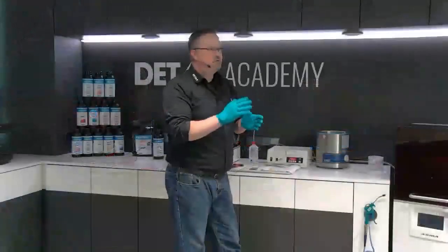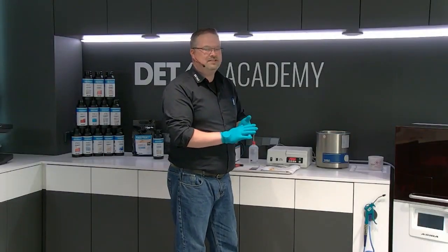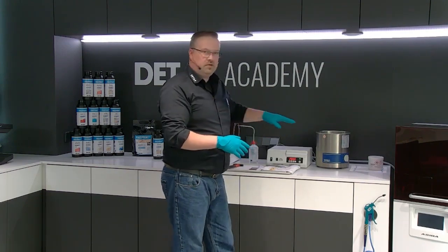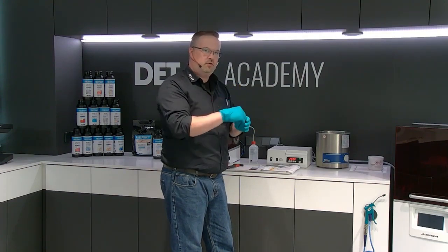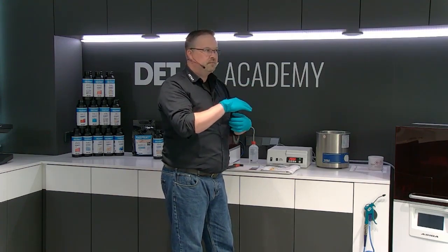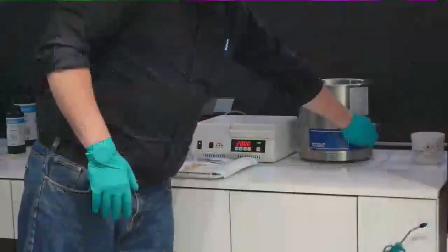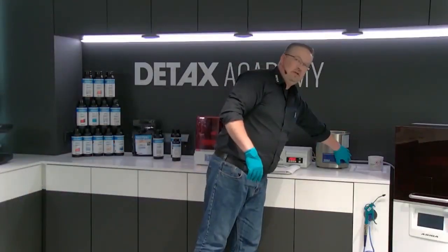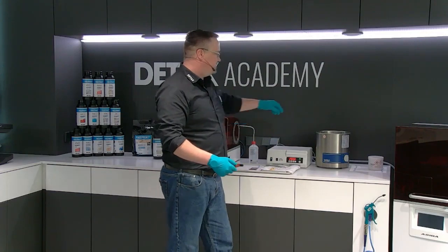Please, I saw it often, never, never, never use isopropanol alcohol directly in the ultrasonic bath. In our ultrasonic bath, there's water inside. You use a small box. In the small box, you can take the isopropanol inside, and you need any function to close it. Now, we clean it only for 1 minute in the ultrasonic bath. After that, we take it out of the bath.